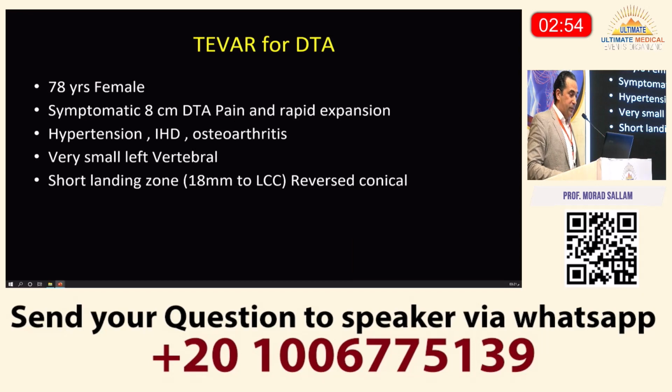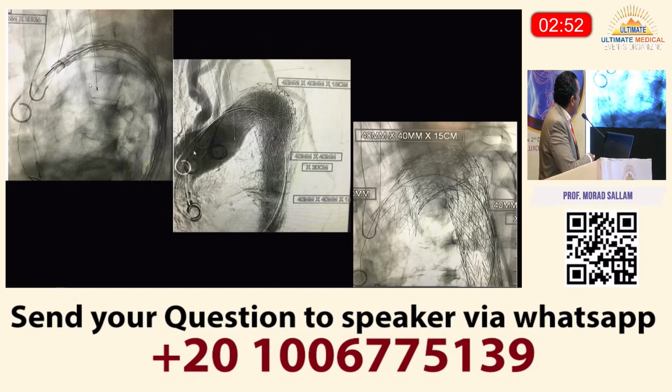bit of a difficulty. What I want to highlight here is the difficulty was the right projection to separate innominate, carotid and subclavian to see the landing zone without having parallax in the graft. So we ended up putting a Gore graft, which slipped a little bit on deployment. And I think part of it, we were a little bit distal, and the other part was just because of the deployment. We didn't take all of the tension.